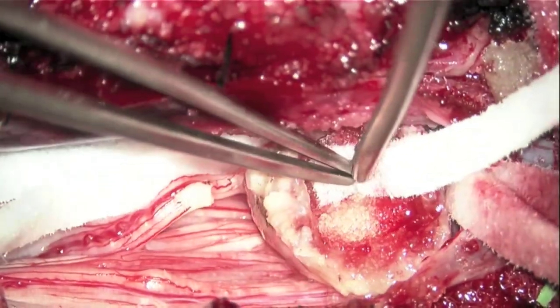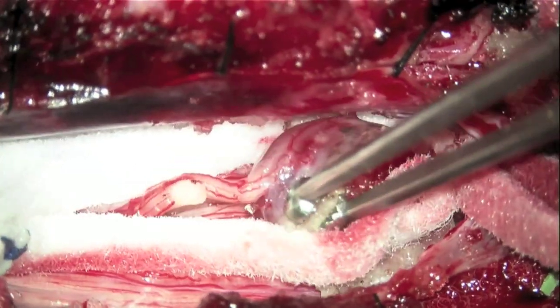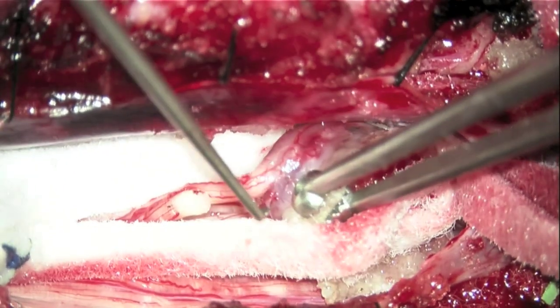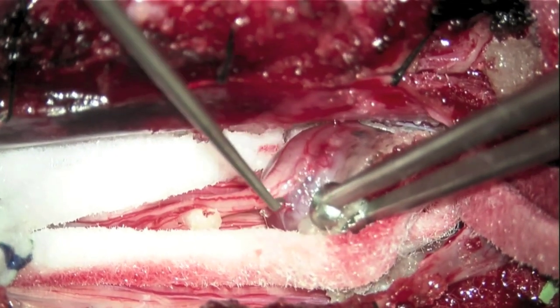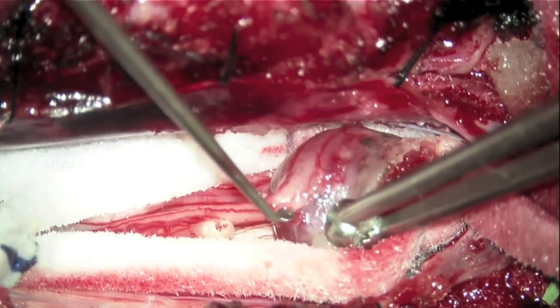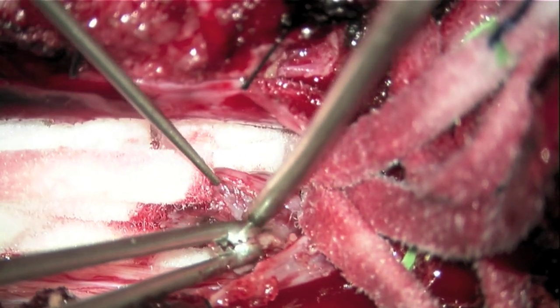Internal bleeding is easily managed with FlowSeal and gentle pressure. Once there is adequate visualization of the entire course of the corresponding nerve root, mobilization of this root off the tumor capsule is begun. Here, I'm working at the proximal afferent component of the nerve. I'm now at the distal efferent aspect of the corresponding nerve root.